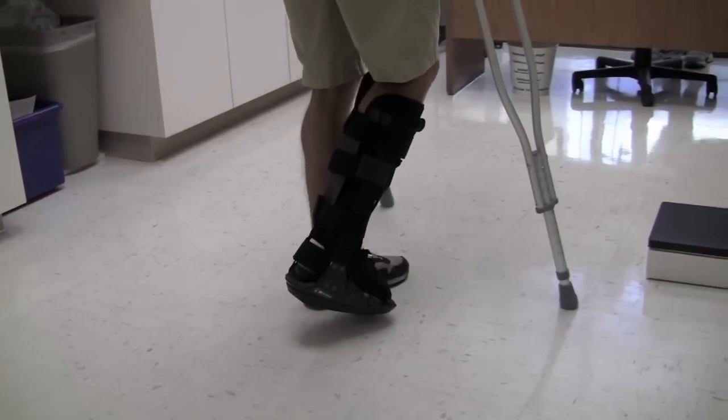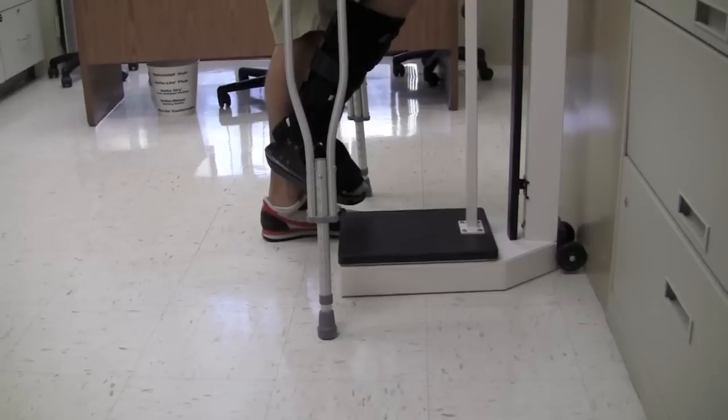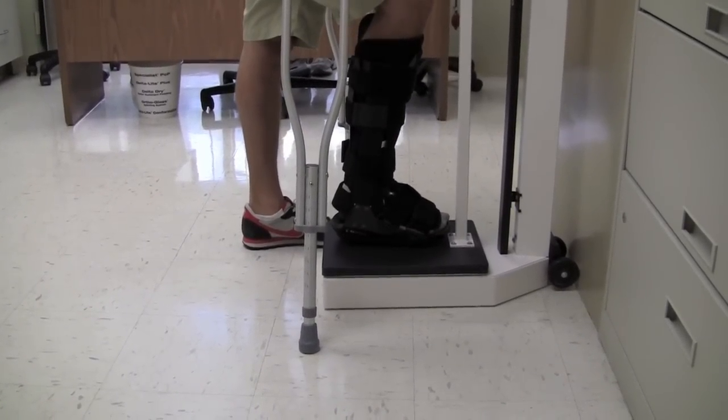In this video we demonstrate partial weight bearing. The patient is going over to the scale to determine how much weight is being placed on the foot.